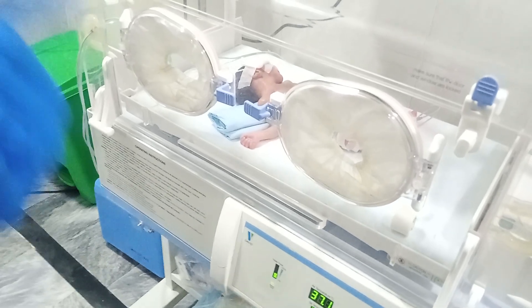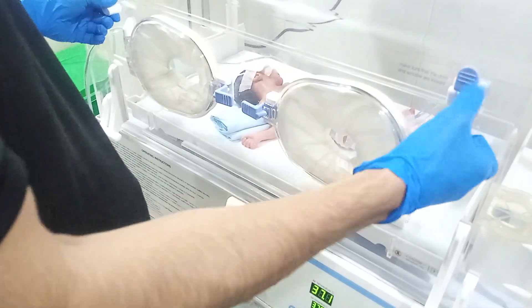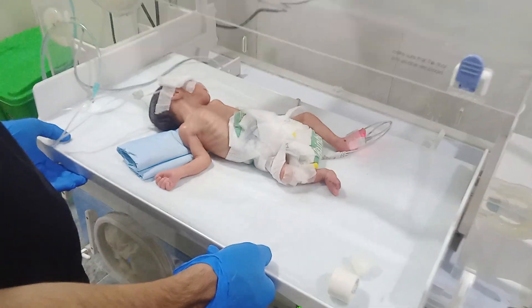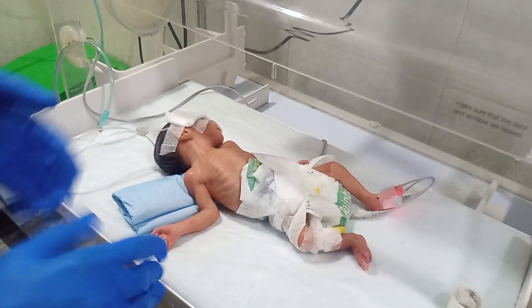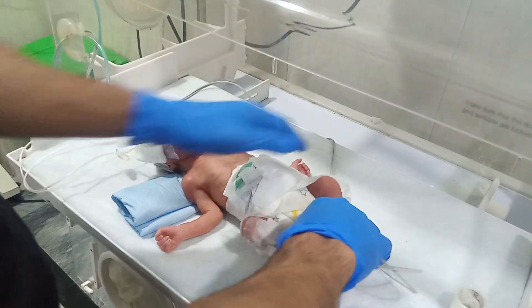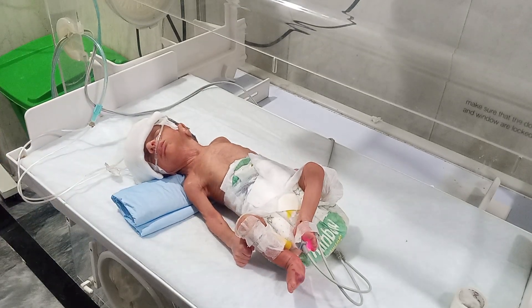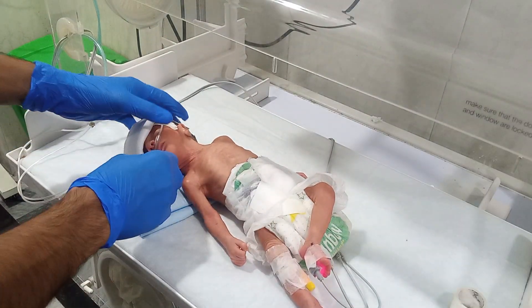Hi, hello everyone, welcome to another video of the preterm baby. This is a cute preterm baby. We are going to check the RBS of the baby and check the belly routine. The baby has recovered a little bit but is not fully recovered yet. We are giving them medication and everything to support recovery as soon as possible.